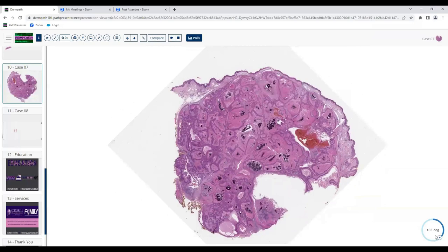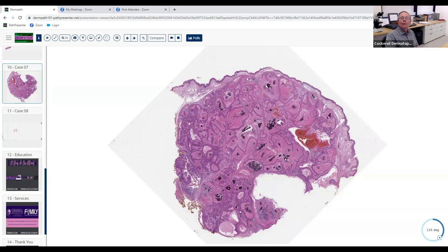This next case: from low power it looks mostly in the dermis. The first thing that jumps out is a bunch of different nodules with a rolls-and-scrolls appearance. There's a reddish area in the bottom right that looks like hemorrhage and dark purple areas that look like calcifications. Is it neoplastic? Yes. Benign or malignant? Benign — but tell me why from low power before we go to high magnification.